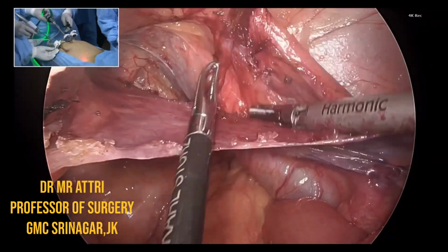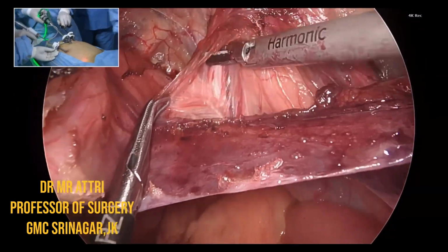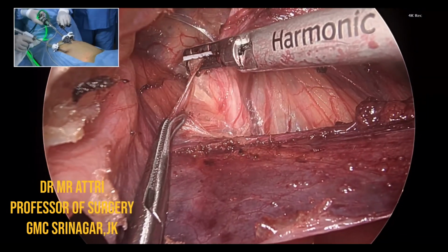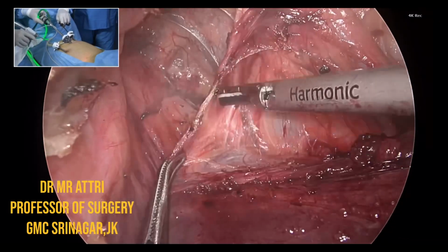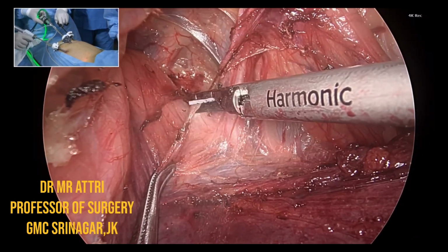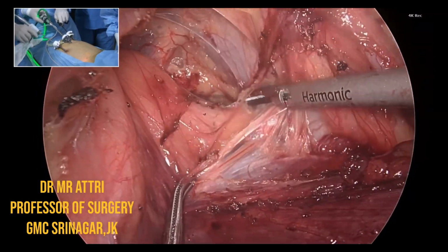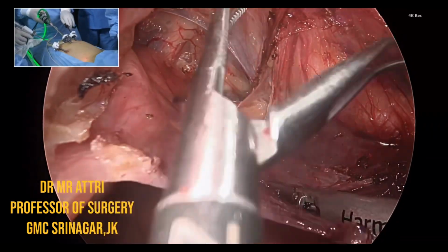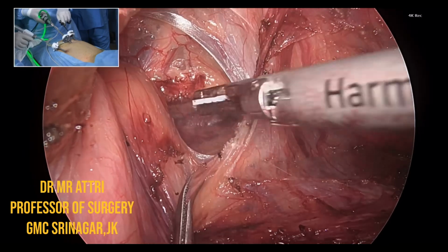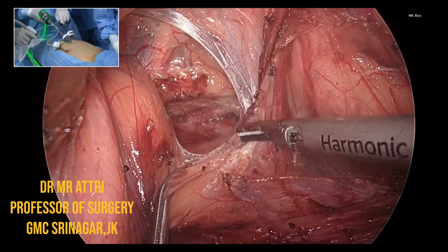I think it's not audible. You can ask us. How does he compare right-sided ETEP TAR versus TAR with IPOM? How does he compare that? Dr. Sumit, did you get the question? So actually the audio is not very clear. Okay, could we have Dr. Safraz answer this question for the time being? Sorry, repeat the question, please. How do you compare, in this patient, doing right-sided ETEP TAR versus IPOM TAR?